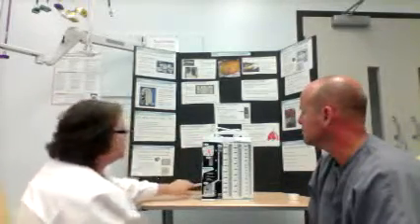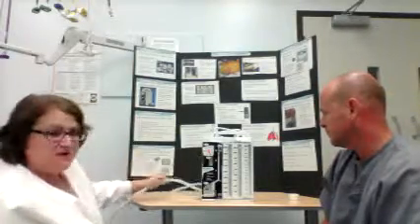Okay. And then another, and I think that was it for the air leaks. You also want to look at the catheter, make sure that it's not kinked and that the tubing hasn't become elevated higher than the chest tube system. And then if you still can't find anything, you might want to notify the physician that there's a problem with the system.